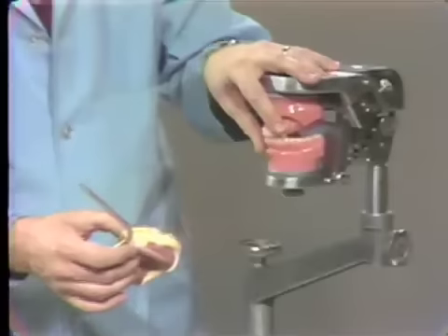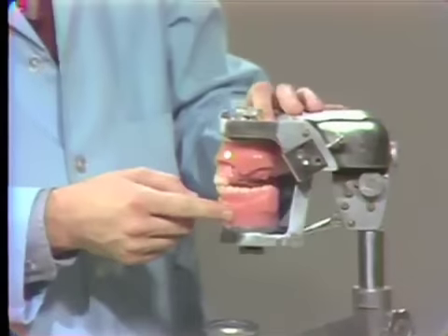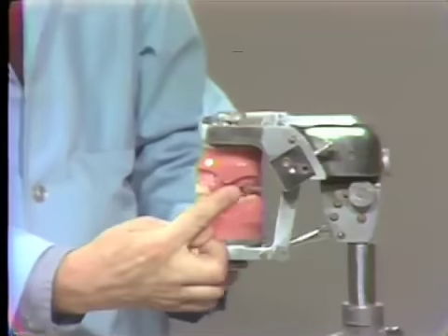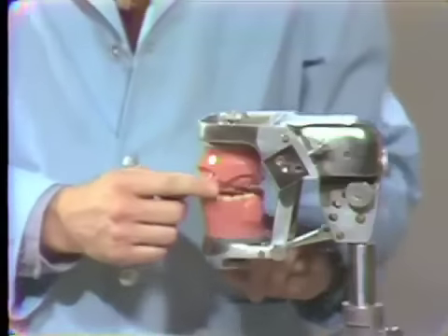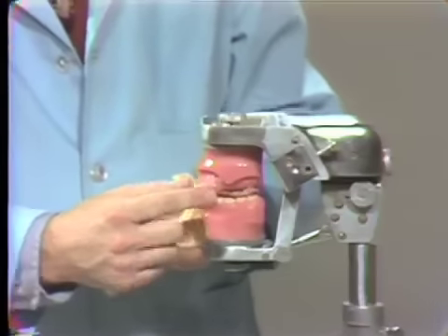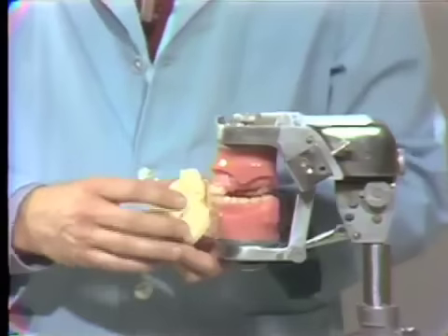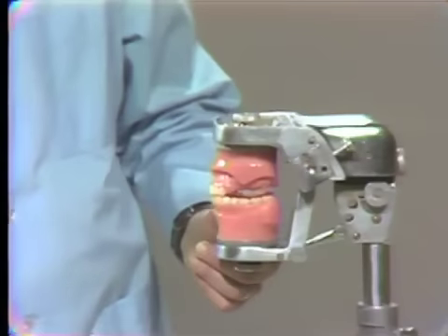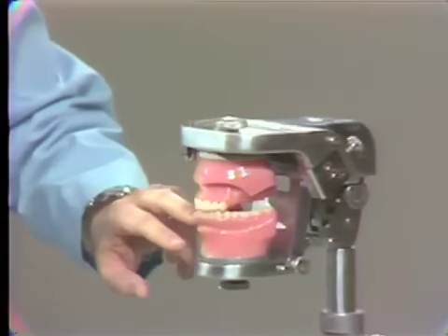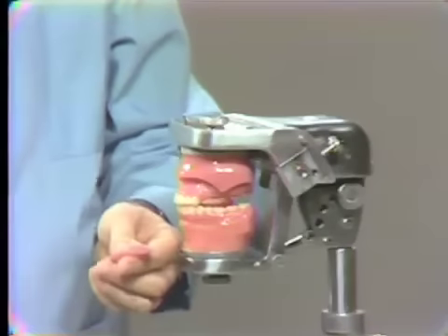Coming back to the mannequin — now that we have transferred the maxillary cast to the articulator, we still have to record our intermaxillary relations: centric and vertical. Because this is so mechanical, it's just a matter of keying the two together when the mechanism is locked in place. Since the master casts supplied are somewhat different in shape from the acrylic resin cast we've had for three or four years, transferring using an accurate base plate does not work well. So for this exercise, I think it would be perfectly alright if we simply warm up some wax, place a mass of wax along each occlusal surface of the lower arch, and then close the articulator to make bite registrations.